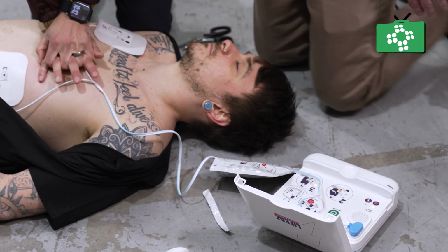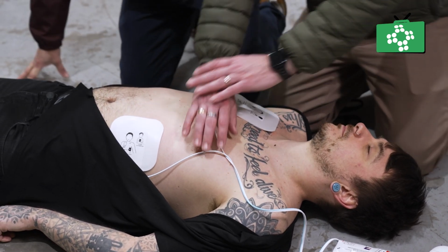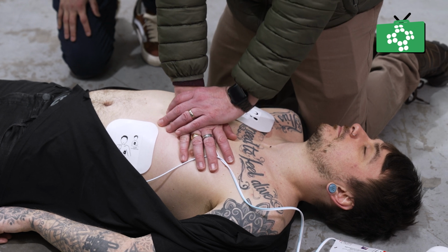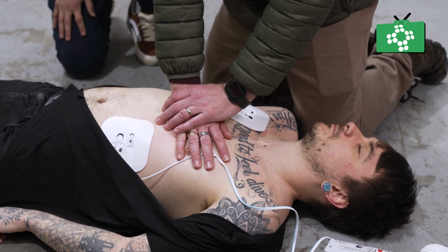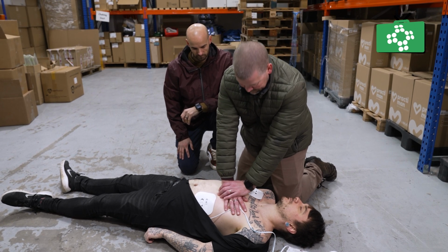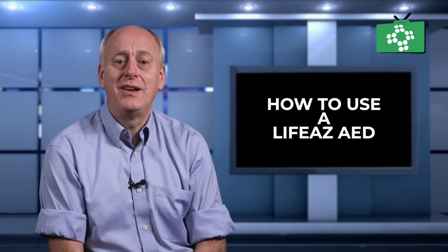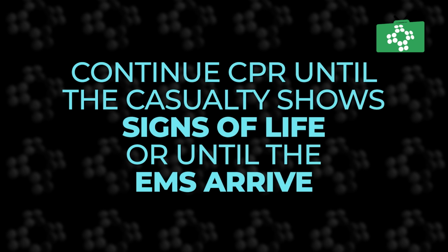If no shock is advised, continue CPR. Keep following the AED prompts until professional medical help arrives or the patient shows signs of life. If working alone, continue until you are physically unable to do so. Using an AED quickly can increase the victim's chance of survival, and it's essential to apply the AED as soon as possible. Using an AED may sound frightening, but they are easy to use and you could save the person's life. Stay calm, follow the voice prompts, and trust the AED to guide you until medical professionals arrive.